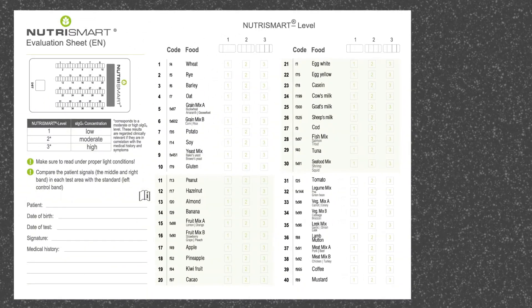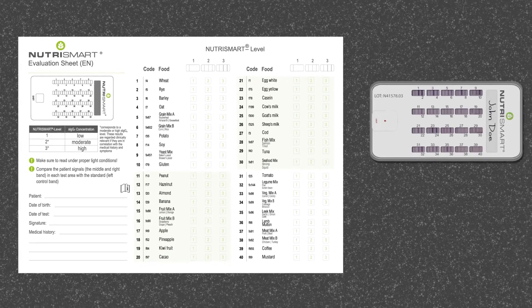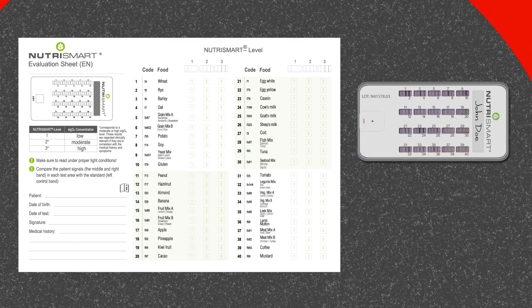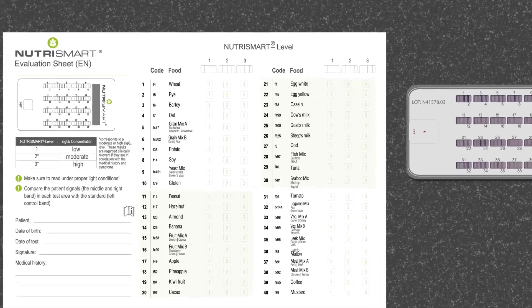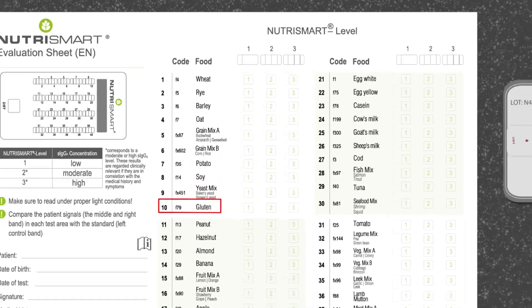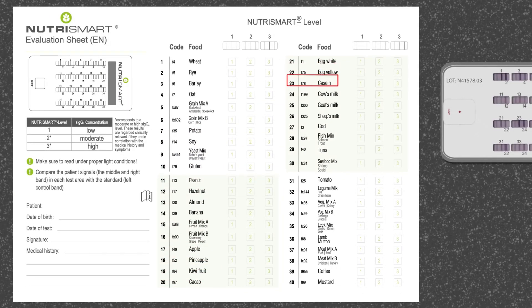Use the NutriSmart evaluation sheet to determine the patient's results. The numbers on the evaluation sheet correspond to the numbers on the cassette. Both the sheet and cassette each have 40 numbers. Each number represents a specific food or food group. Number 1 on the sheet represents wheat, number 2 represents rye, number 6 represents corn and rice, and so on until we reach number 40.